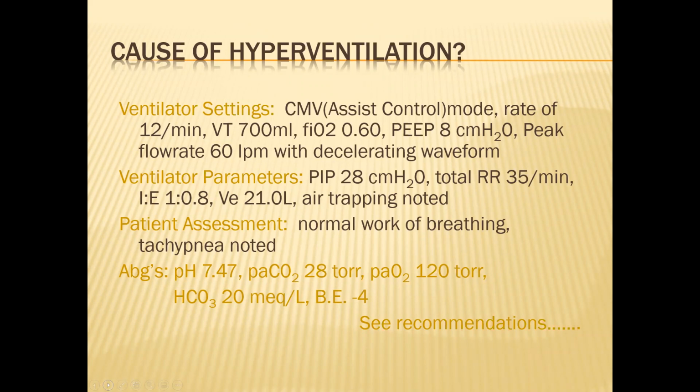Yeah, pressure support is such a nice mode. It's so comfortable for the patient. It gets rid of a lot of the issues of us trying to adjust the I times and get them to meet the patient's needs. When they're in pressure support, they have a lot more control over their tidal volumes, I time. So yeah, it's definitely more comfortable for them. So yeah, we could have a respiratory alkalosis because of damage to the brain, and the brain's response is hyperventilation.